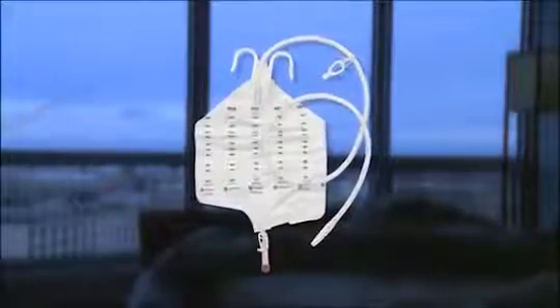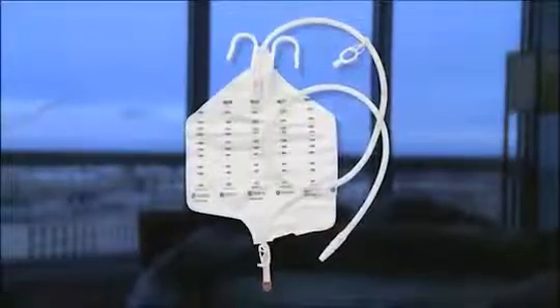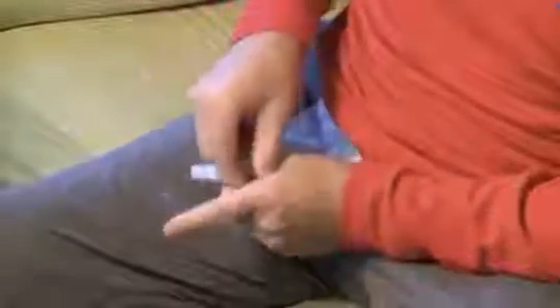If you use a nighttime drainage bag, you will need to attach the Hollister urostomy drain tube adapter to the bottom of your pouch. To use the adapter, first remove the valve cap if there is one on your pouch. Then push the adapter onto the pouch drain valve until you hear an audible snap.